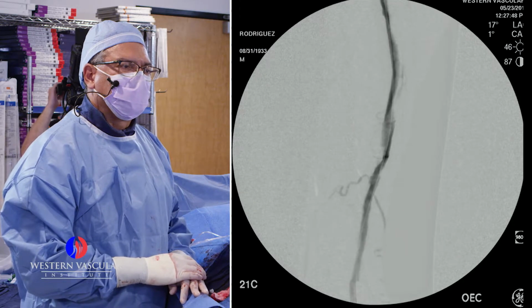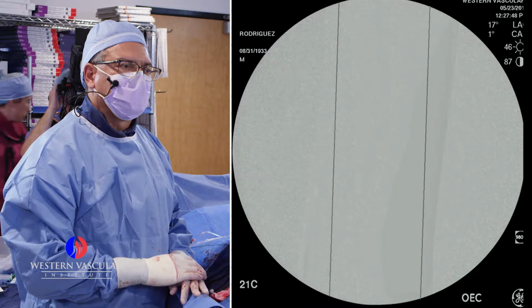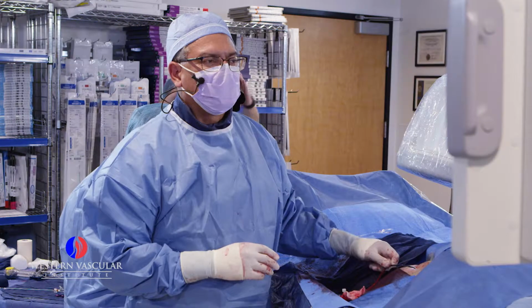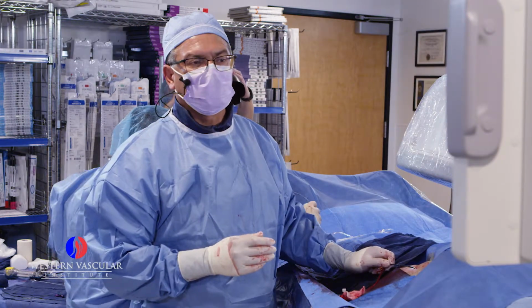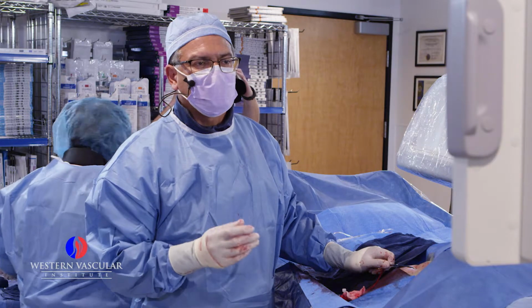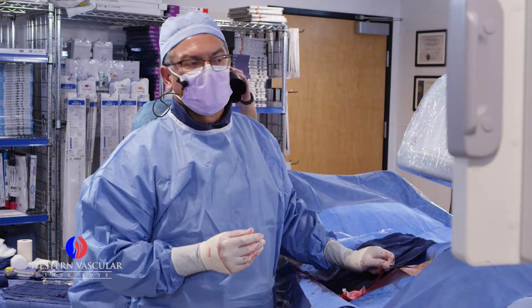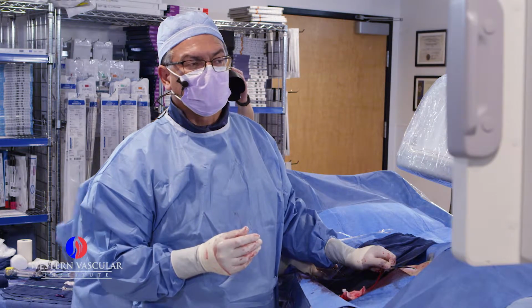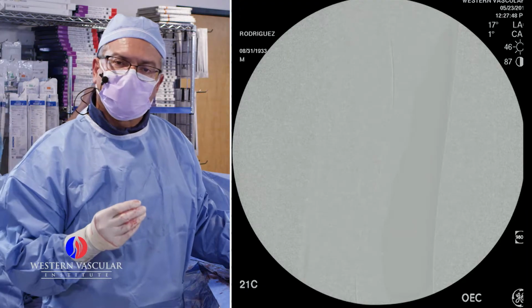So I think the decision here is to deploy the stent. That's going to be the only way to contain the plaque in that side. The decision process of using a stent versus just doing angioplasty obeys basically on the cosmetic result of the angiogram. Sometimes we use the IVUS to come out with that decision as well, but here it's very obvious to me that the angiogram doesn't look quite good.